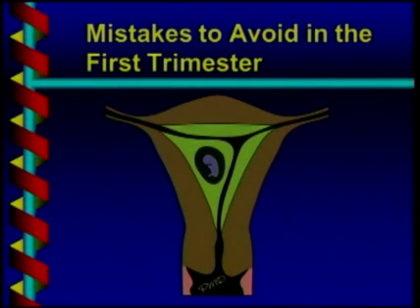In this lecture, I'll be talking about a variety of mistakes to avoid in first trimester ultrasound. The kinds of mistakes that I'll be talking about are ones that if you do make them, they could have potentially very serious consequences either to the pregnancy or to the mother.